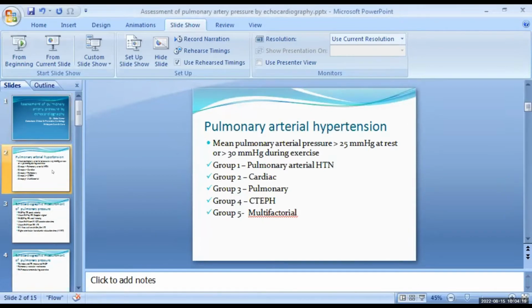Pulmonary hypertension could be a complication of cardiac or pulmonary disease, or a primary disorder of the small pulmonary arteries. Transthoracic echocardiography can be used to investigate and quantify the pulmonary artery pressure, as well as assess the contribution of left ventricular systolic and diastolic dysfunction, valve function, and congenital lesions to the etiology of the pulmonary hypertension. Elevated pulmonary pressure measured by echocardiography is associated with increased mortality irrespective of etiology.